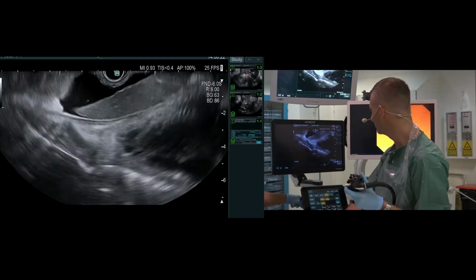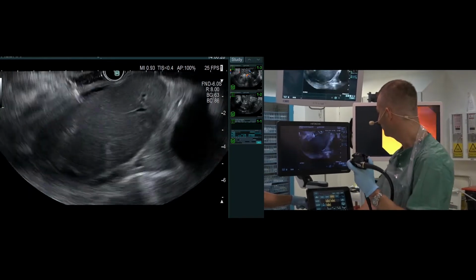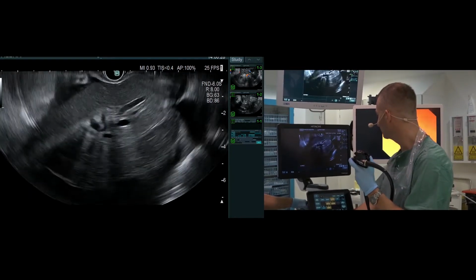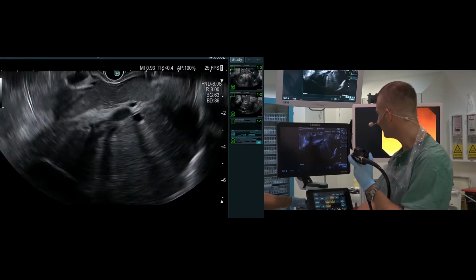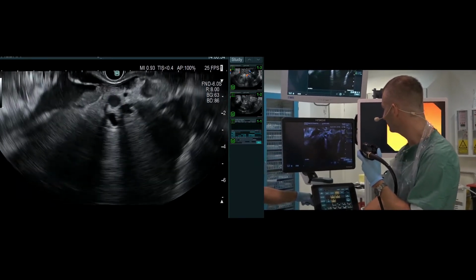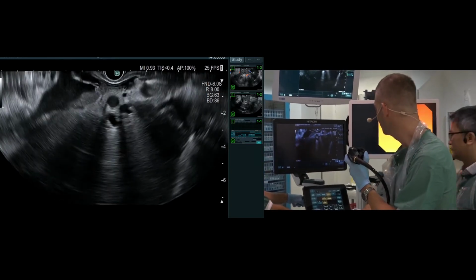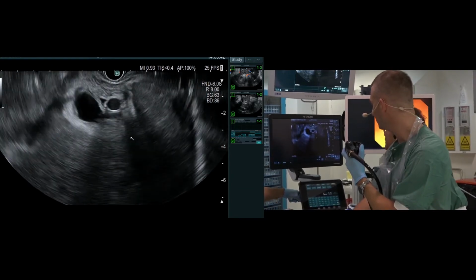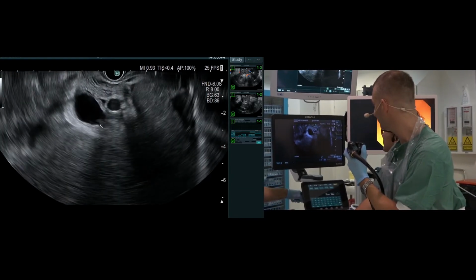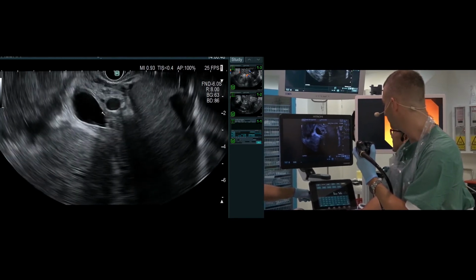anatomy and abnormal findings. So you see the ascites here around the liver. We're looking at the liver where we can appreciate intrahepatic bile duct dilation. We continue to the portal vein, which is in the middle. Maybe I will ask Khan, maybe he can point with the pointer. And now you can see below, or to the left from this, the bile duct dilated up to the hilum, and above it we see the portal vein.